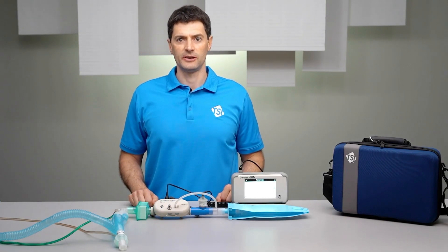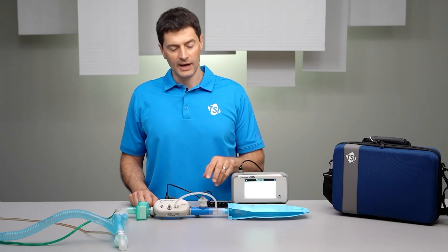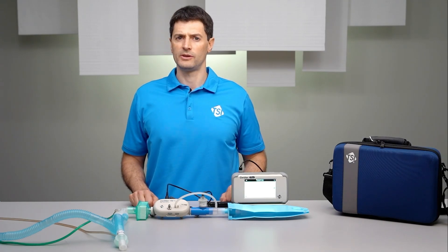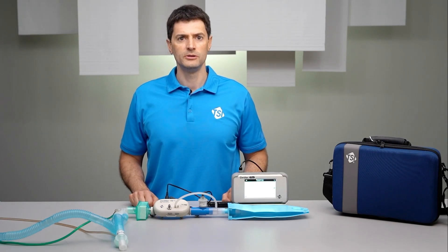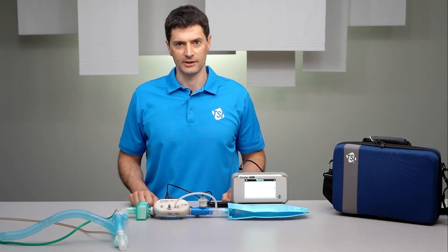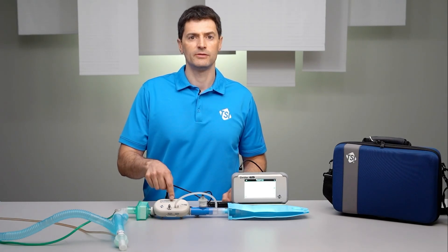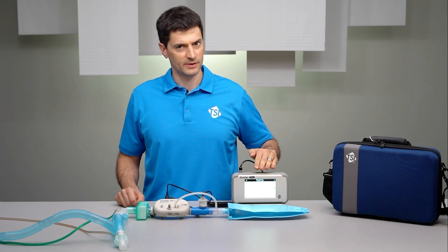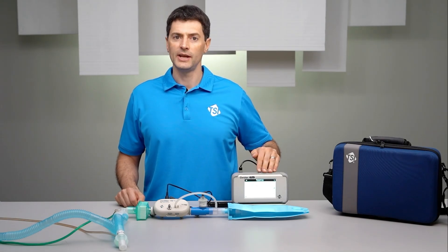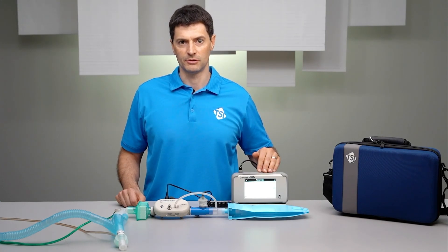If using an oxygen sensor, it's recommended that you calibrate it before testing. The oxygen sensor can be calibrated with either a one-point air-only calibration or a two-point air and oxygen calibration. With the oxygen sensor connected to the high-flow module, select oxygen sensor in the settings of the Certifier interface and the on-screen prompts will take you step-by-step through the calibration process.